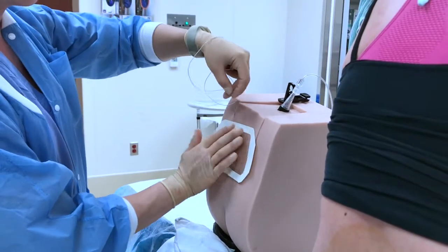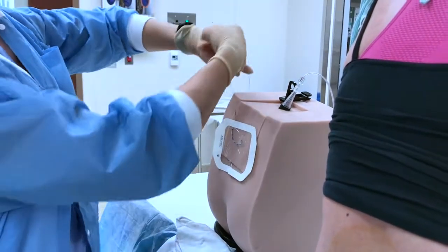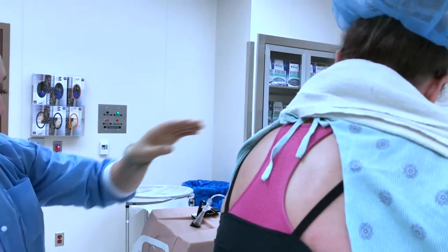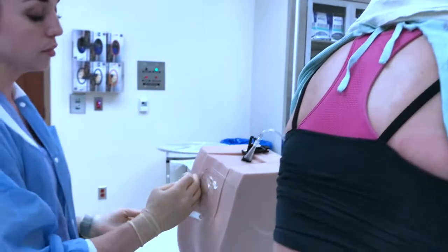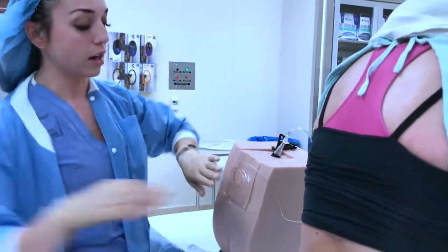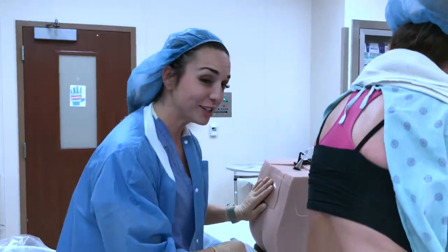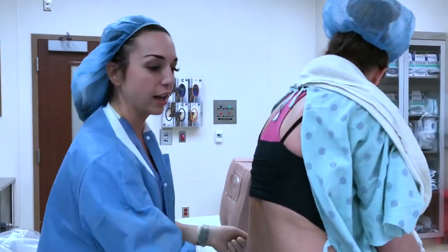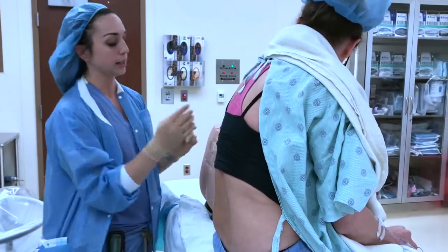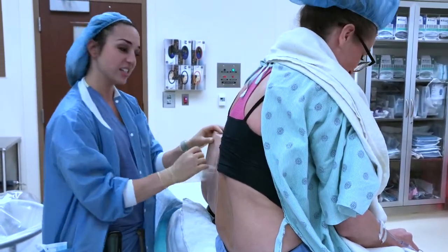And then you get your little loop, put your Tegaderm on there, and then we usually put it over the shoulder of the parturient, take off the Tegaderm. And then I always forget to do this, but right before we lay her down, she's gonna have that fetal monitor, and you just make sure that you put the band back up to secure it, lay mom down, and then that's it.